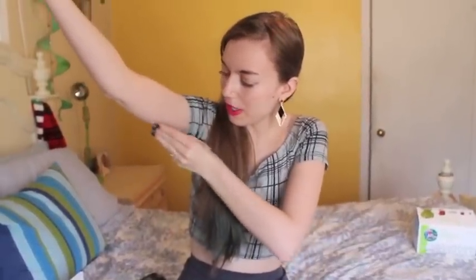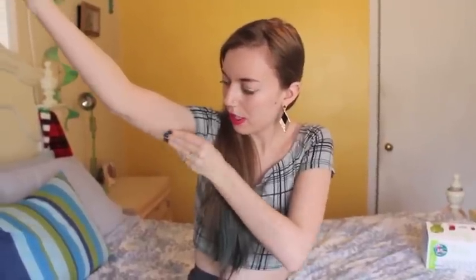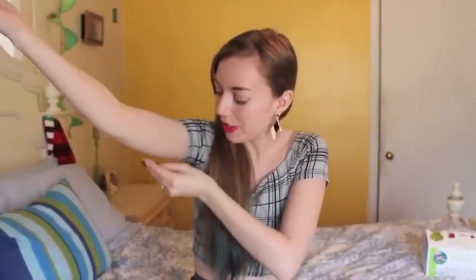You just want to gently wipe the area that you're planning on putting it on. And be patient letting it dry. Don't blow on it or anything like that.